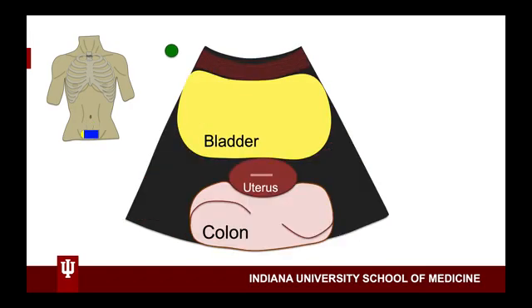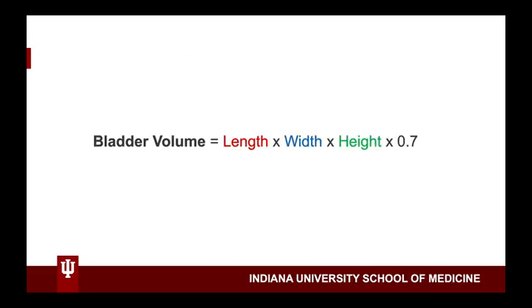After completing your sagittal measurement, you will rotate the probe counterclockwise so that the marker dot is pointed towards the patient's right. You will then drag the probe up and down until you again find the greatest dimensions of the bladder. Once you have done this, freeze the image. Select the caliper or measure icon and measure the bladder to obtain its height and its width. Once you have obtained these three measurements, get out your calculator and plug them into our equation to determine the bladder volume.